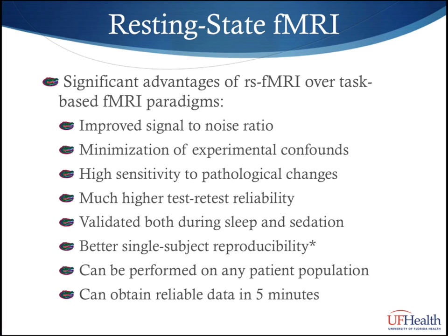Additional benefits of resting state functional MRI include the ability to perform in any patient population because no interaction on the patient's part is required. Reliable data can also be obtained in as little as 5 minutes, which is a tremendous advantage over task-based studies.